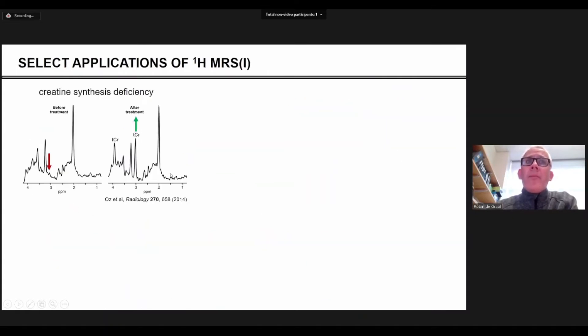Well clinically there are many examples. This is a very obvious one where we have a subject that has a creatine synthesis deficiency and the creatine signal which should be there is completely gone. When the subject then undergoes creatine supplementation, you can see that over time the creatine signal goes up. So a very clear-cut clinical example of the use of MRS.